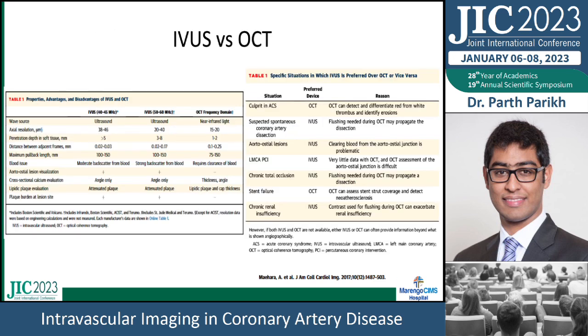In terms of what is the difference between IVUS and OCT, there are multiple different IVUS catheters which are available, and there's a single OCT catheter. So IVUS works on the principle of ultrasound, whereas OCT works on the principle of infrared, near infrared light.